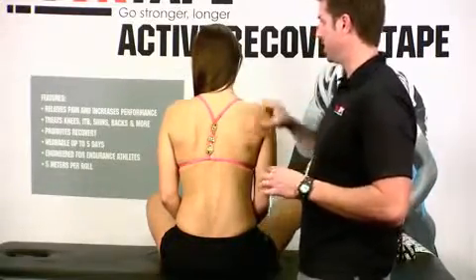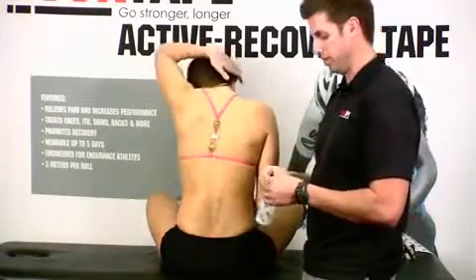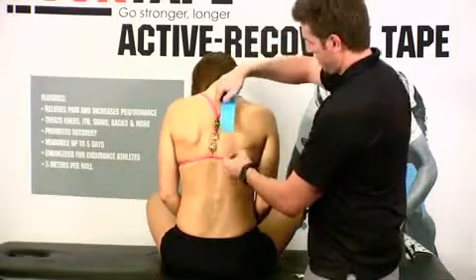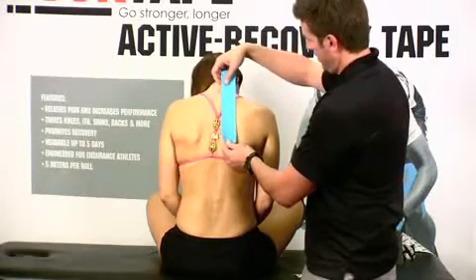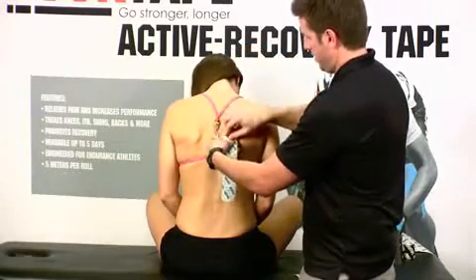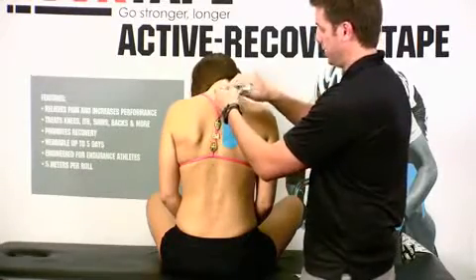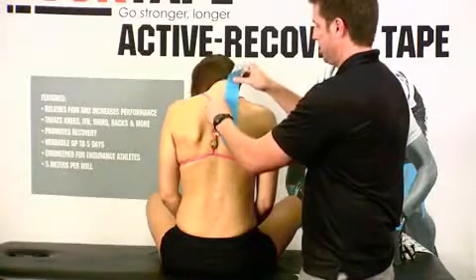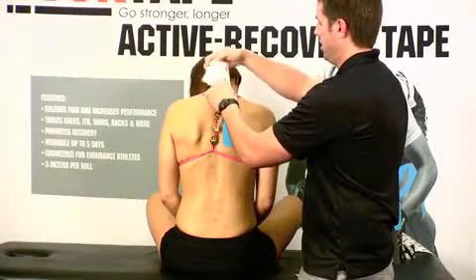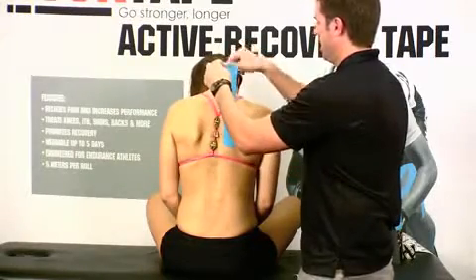We're going to start on her right side. Have her flex her head, chin towards her chest, as comfortably as possible. Tear the backing off the tape. I'm going to start at the inferior portion here, right around the rhomboids. As I pull this backing off, you may notice — especially for females — they have a bra strap through there, so you just want to try and lift and go up underneath. Go ahead and lay that tape on down.